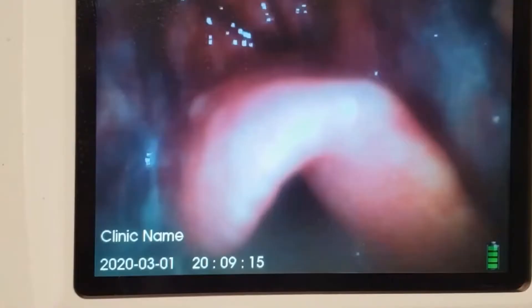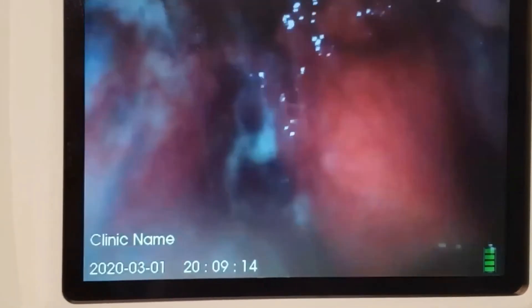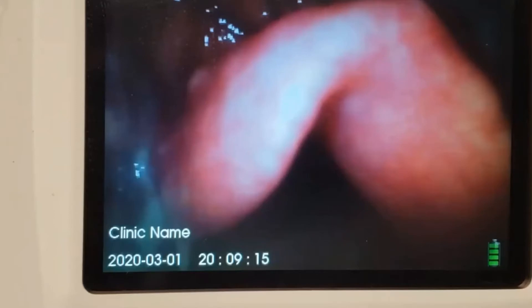In our first carve-out, I want to point out some amazing anatomy. What you see here is the epiglottis, and then deep behind it is the vallecula, and you can see the hyoepiglottic ligament. However, I also want you to notice that we appear to be pretty far away from the vallecula. Keep that in mind — the tip needs to go into the vallecula as I progress.